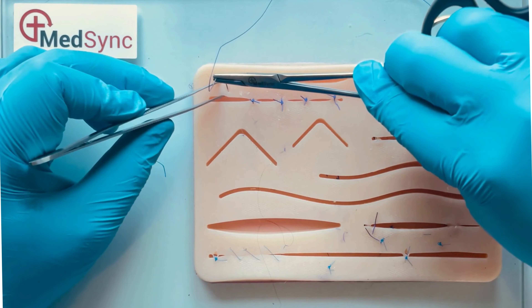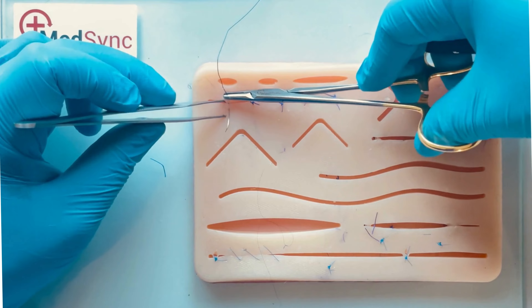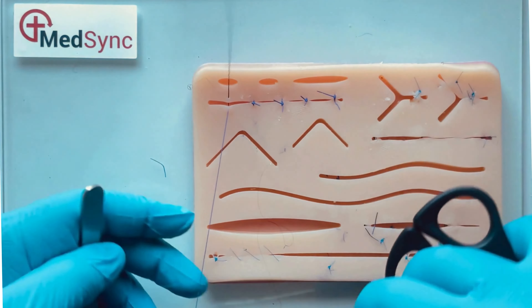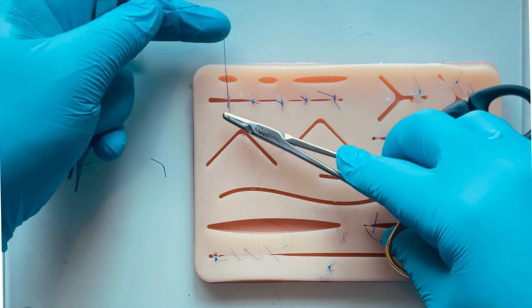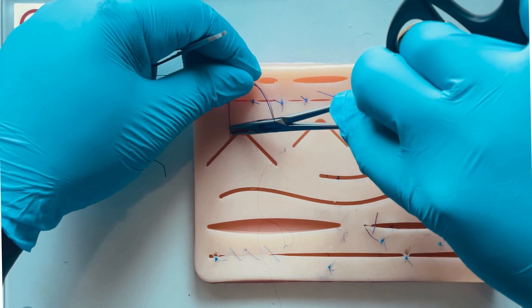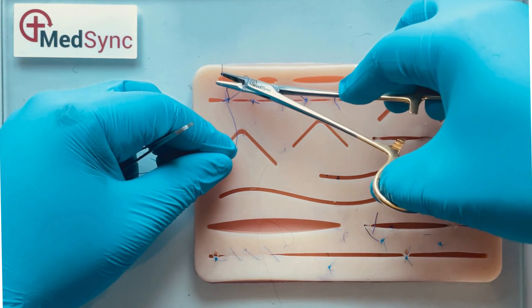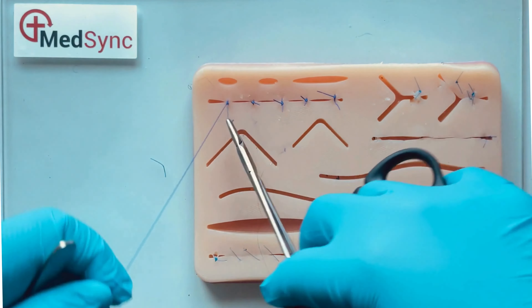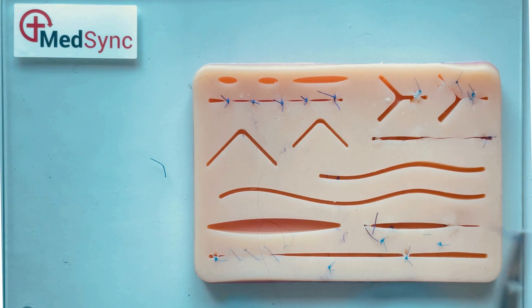When you place your sutures across a wound, ensure they are evenly spaced, at the same distance from the wound edges on both sides, and the knots lay on one side of the wound itself. Wrap the suture around the tips of the needle holder and retrieve the short suture by its tip. This prevents getting caught in knots.